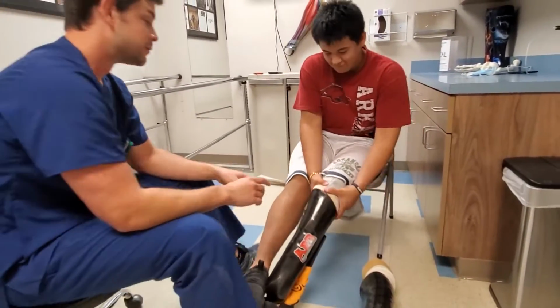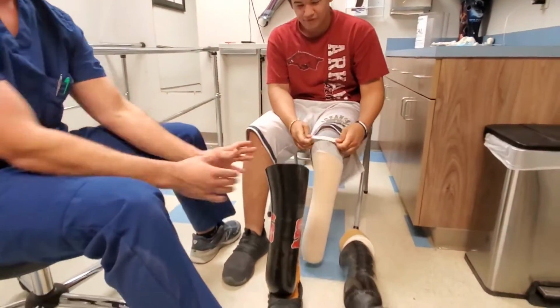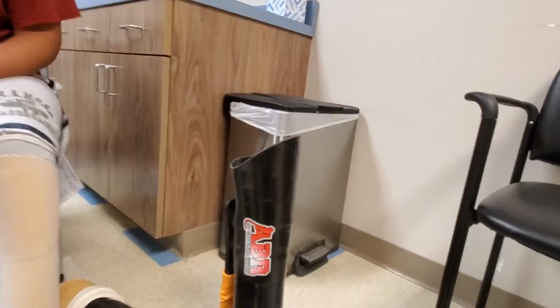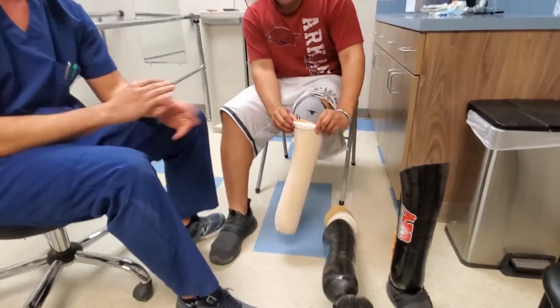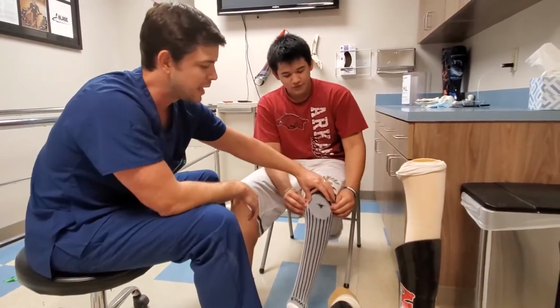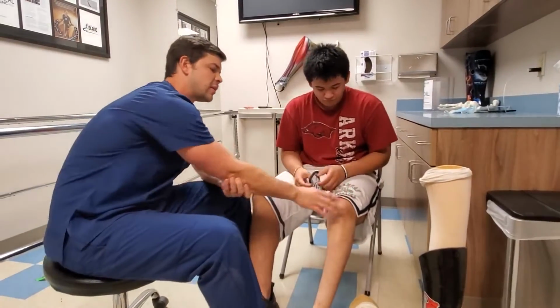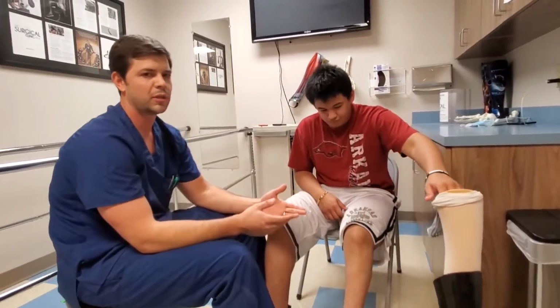Okay, so changing gears here real quick, you might notice that these socket trim lines are a little bit unconventional for a standard transtibial limb. His amputation was from trauma at about 3 years old, I believe. A lot of people who have this type of amputation, it's congenital, but oftentimes it's traumatic. In his case, it's traumatic, so we know that he has all of his ligaments and good muscle strength in his knee. In a congenital case, sometimes you're missing an ACL or MCL, or you might have some muscle lack of development in your thigh that creates some instability when you're walking.